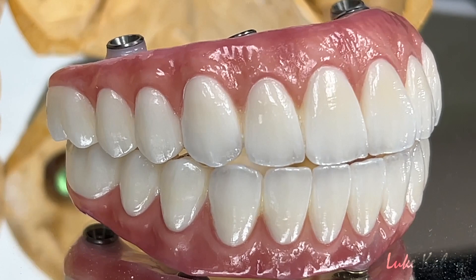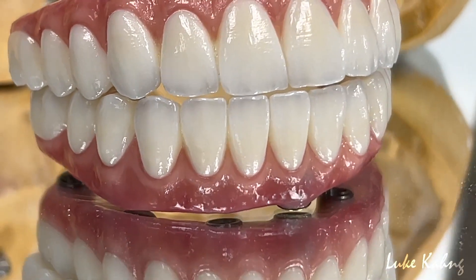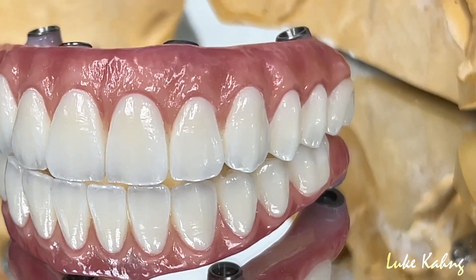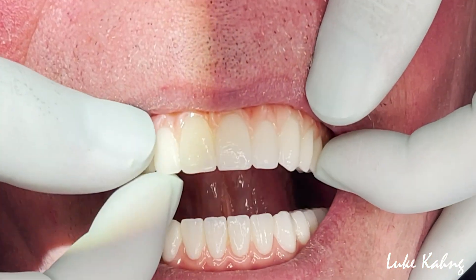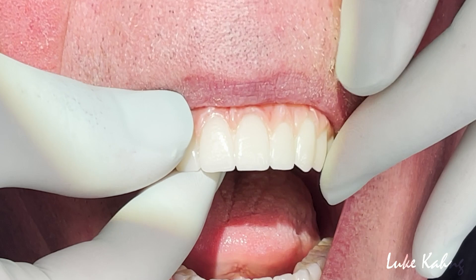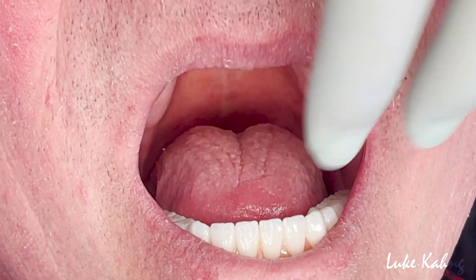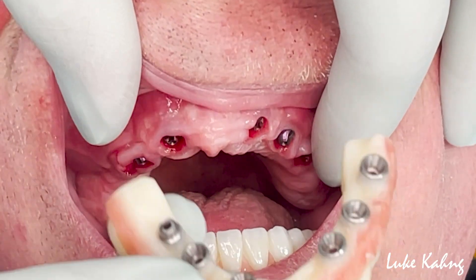If everything's correct, the finished zirconia implants are sent to the doctor to try out in the patient's mouth. While the footage here shows a temporary PMMA arch being placed in the patient's mouth, the procedure is the same for the final restoration.